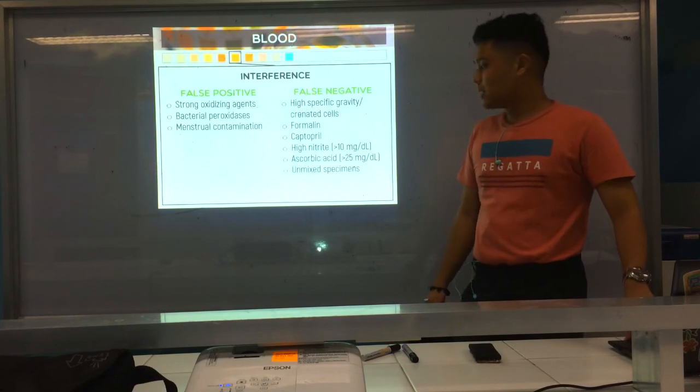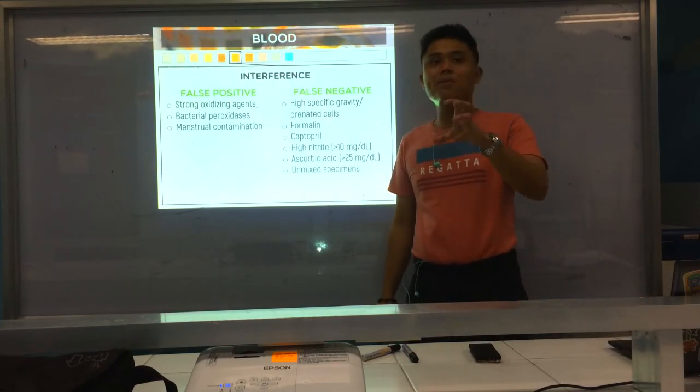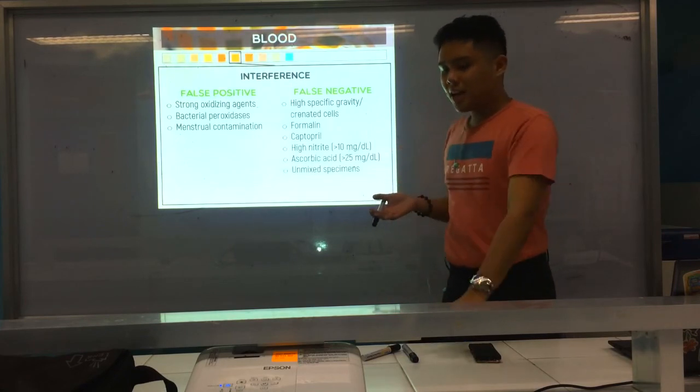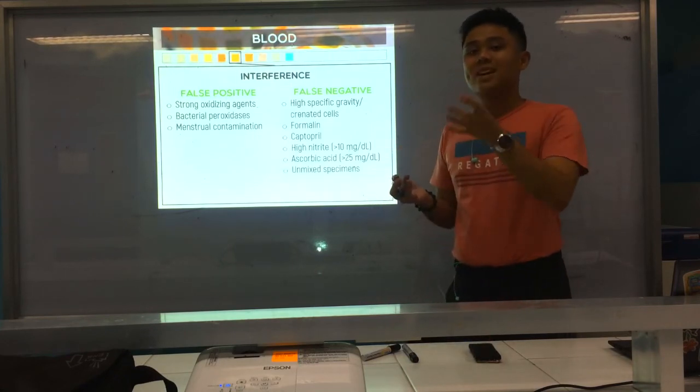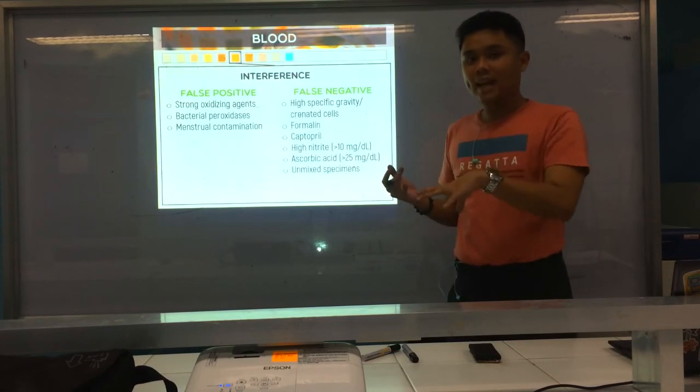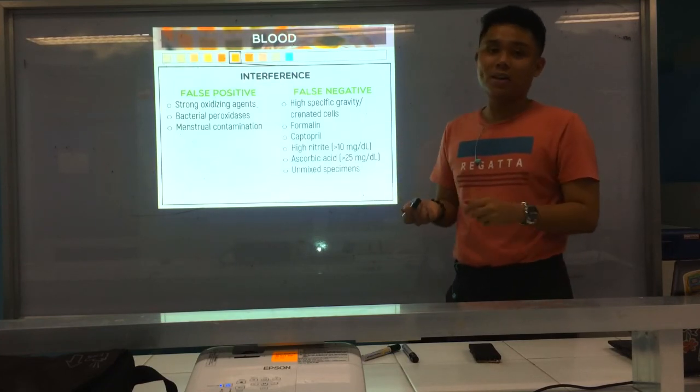Alright? And unmixed specimens, of course, that's why it's really important na before kang mag-chemical exam, imo jo i-mix. Because if gistandra ang urine for a long period of time, the cells settle at the bottom. Now, if dili mo na siya i-mix before nimo i-test, then therefore, dili siya ma-detect sa imong strip.